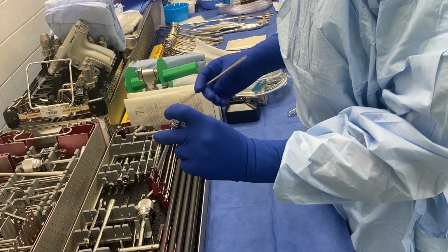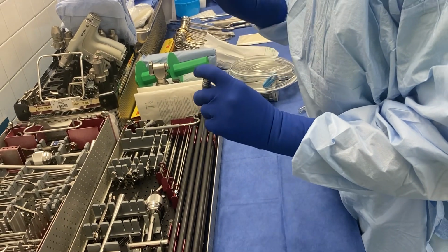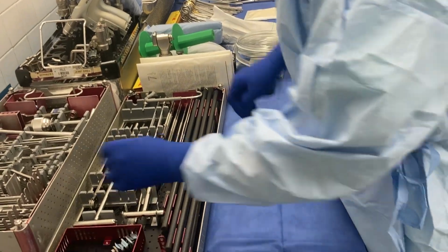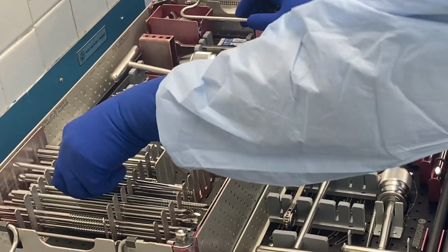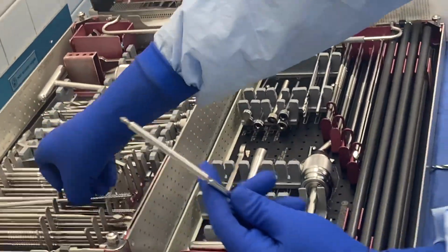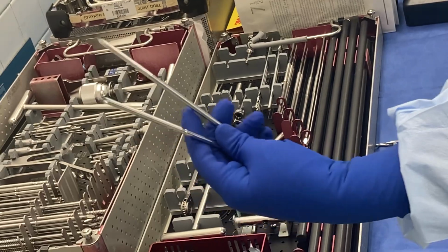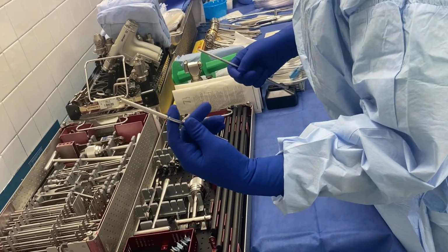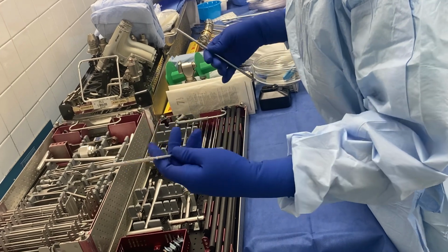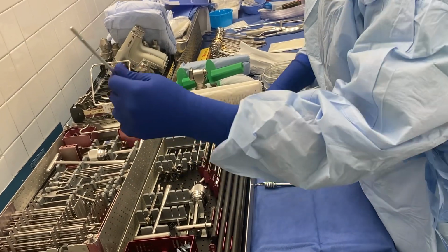So they would put this down on the skin first, X-ray, make an incision, drill, and then we typically use long pins. These are self-drilling pins, and these are not. At this hospital, we usually drill even if they are self-drilling, but they go really long pins, especially for the femur, because of all the tissue. They want this to be able to stick out of the skin so they can attach bars to them.